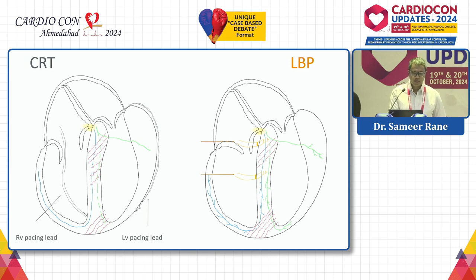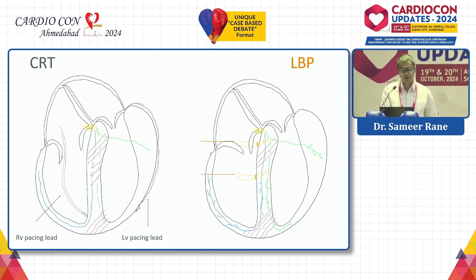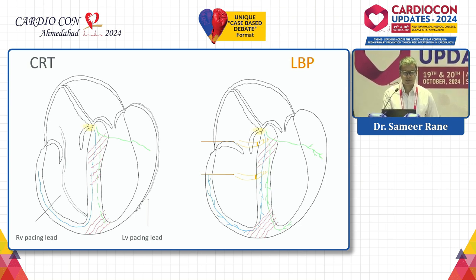You have a right RV pacing lead, and below that the right bundle and this is the left bundle. There is an old anteroseptal MI, so we assume that the conduction system may have been affected there. There is an obvious visible scar on the apex, so yes, that can also affect the conduction system.